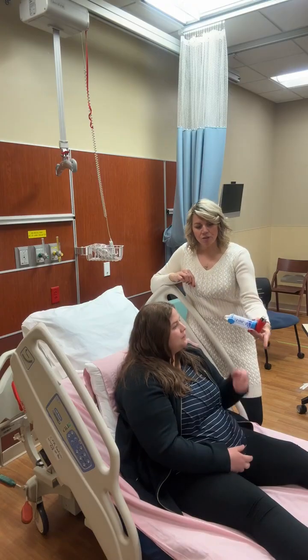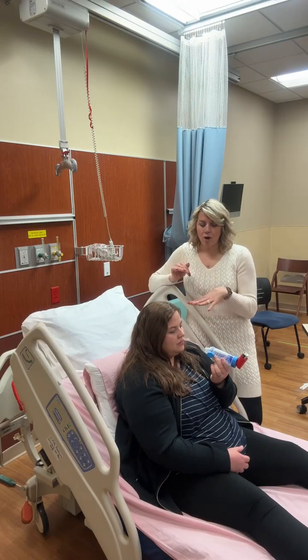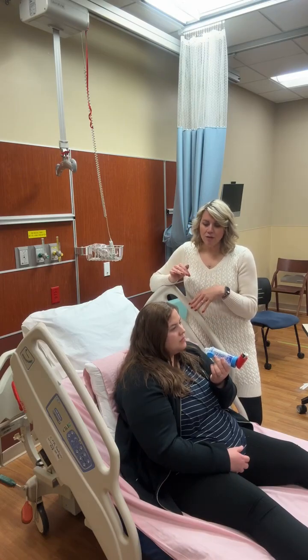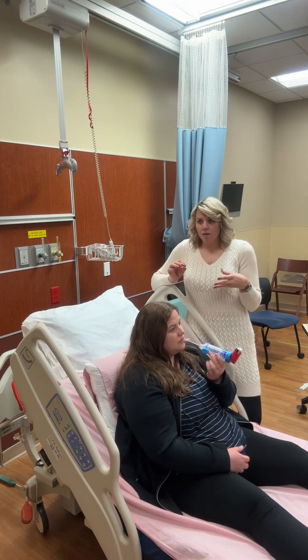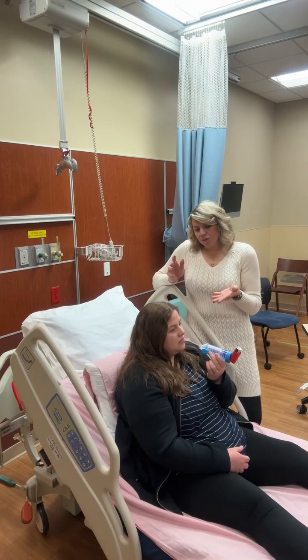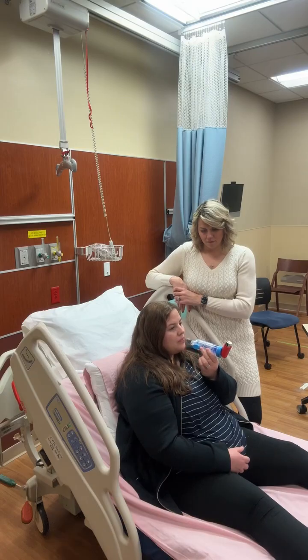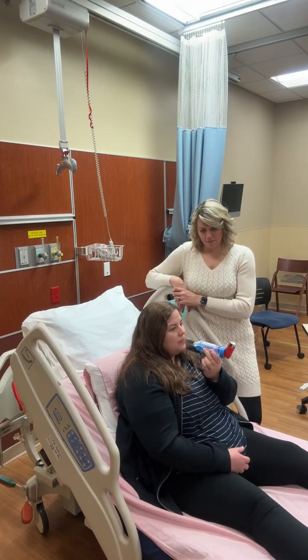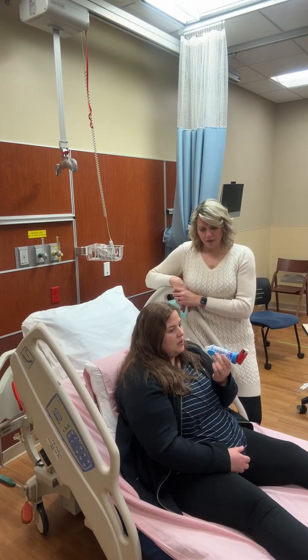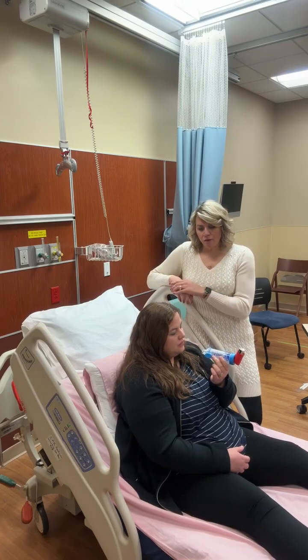So Ashley, what I want you to do is take a slow breath in, and you can take a couple of breaths on it just to make sure that you get all the medication. When the medication goes into your mouth, hold it for a second and then breathe. Take another breath, then hold it and breathe. Up to 3 breaths is usually pretty sufficient. Good. Okay, so with that medication, your doctor ordered you 2 puffs every 4 hours as needed.